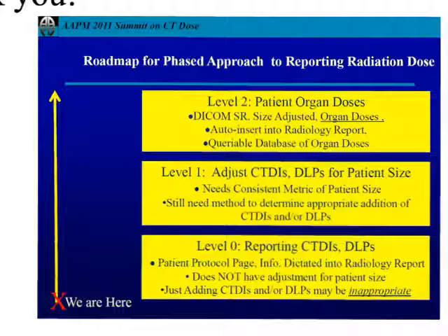So in a lot of the facilities that you're working at, there's a culture, there's resistance to reporting, right? They're not even adjusting CTDIs or even understand what I'm talking about when I talk about adjusting CTDIs. And we have no way of reporting or collecting doses to radiosensitive organs, right? So we are just now stepping out. 2006 was when the big kind of awakening occurred, and we're on the cutting edge of knowledge about these things.